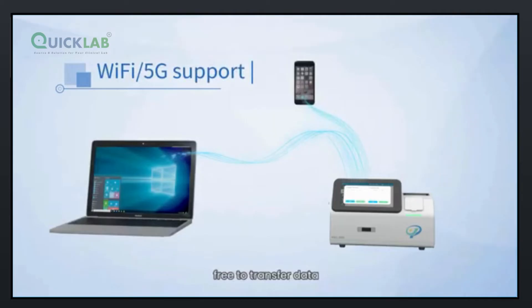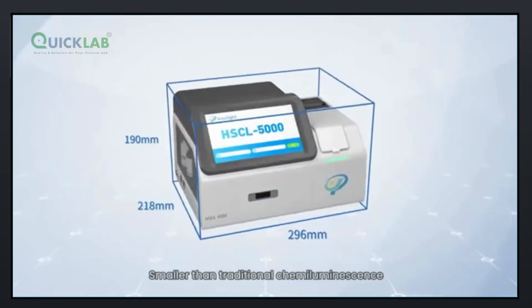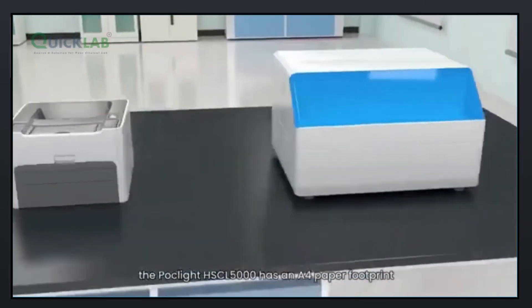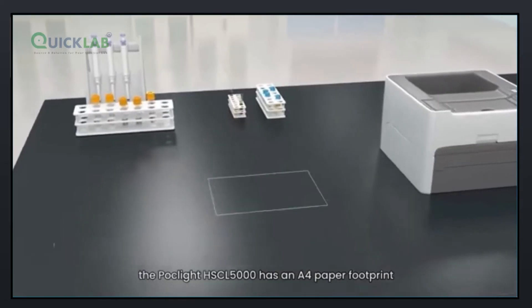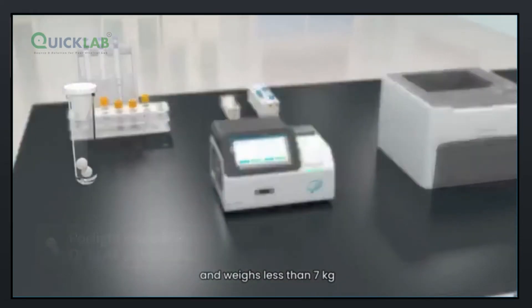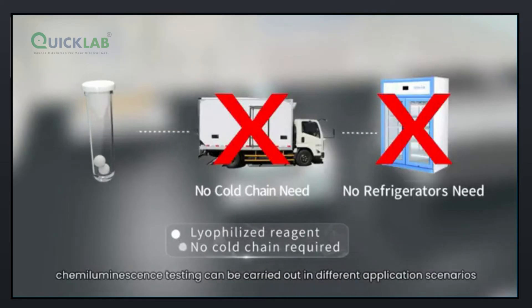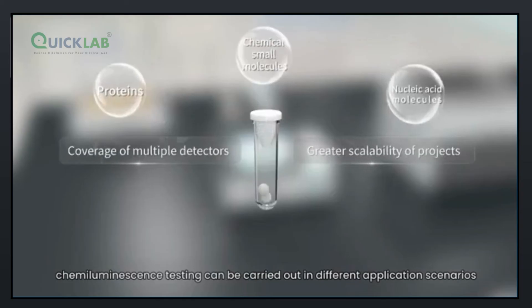Data can be freely transferred, allowing you to view test results and instrument status at any time, anywhere. Smaller than traditional chemiluminescence or similar chemiluminescence devices, the POC-Lite HSCL5000 has an A4 paper footprint and weighs less than 7 kg. Combined with the advantages of lyophilized reagents, chemiluminescence testing can be carried out in different application scenarios.